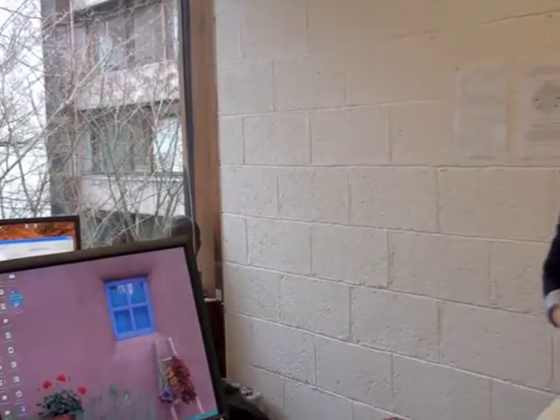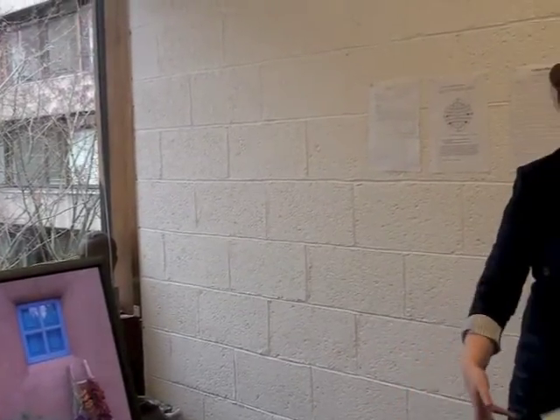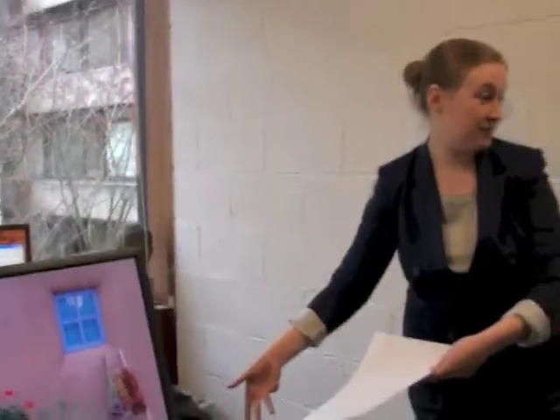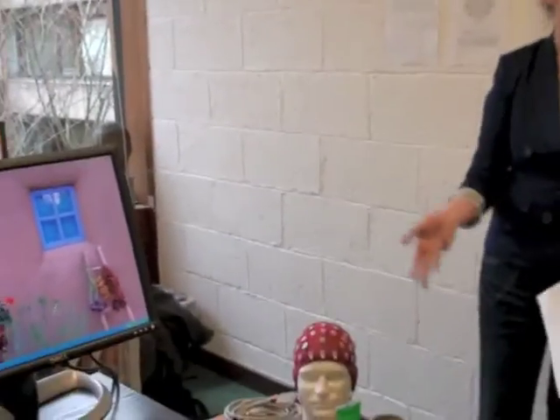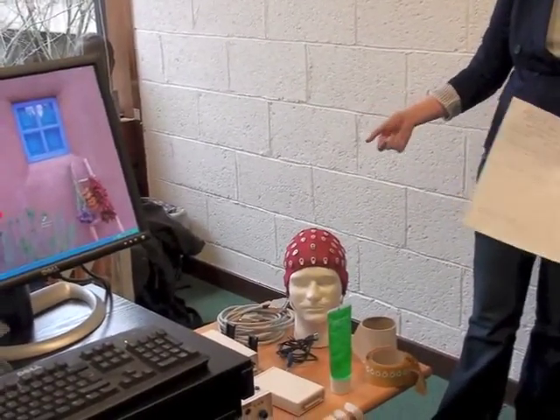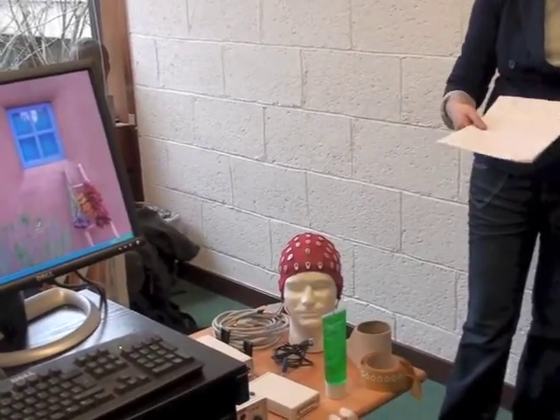So some things you need to do before the participant arrives, that's just handy. I haven't got everything set up here because I want to show you how to do it, but there's about 10 minutes of prep you can get out of the way before the participant arrives. Because the participant is going to probably be set up for an hour and testing for an hour, it's good to have things done beforehand.